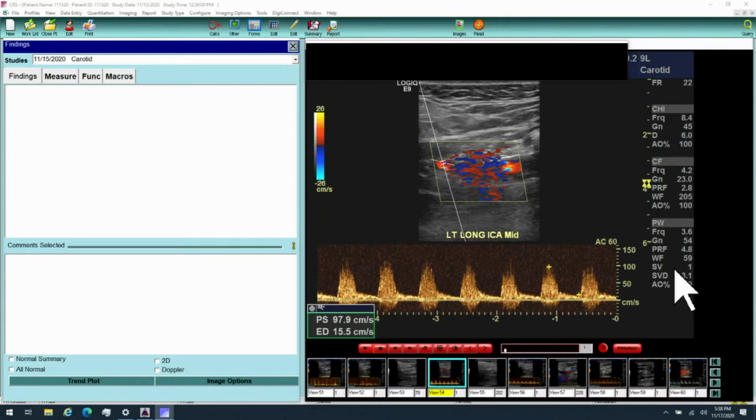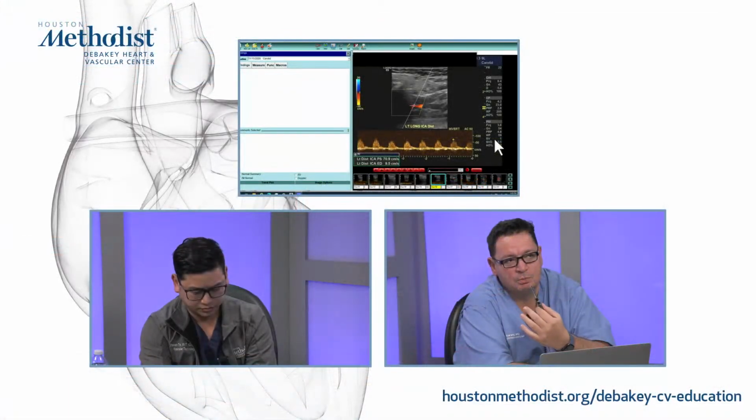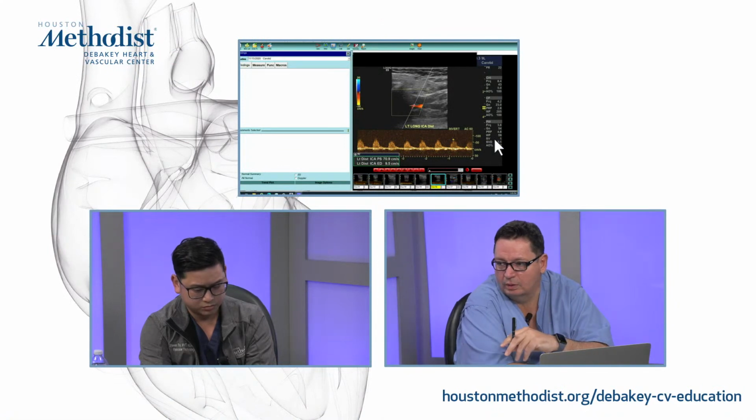The next waveform, I think it's the same. Can you show me the distal ICA? Sure. Same here, no branches, looks like a straight ICA vessel with a high resistance signal. One of the things I would ask is, is this ICA really open distally? With that high resistance signal, maybe an interpretation I would put is potential distal obstruction, maybe this is only feeding the eye, so maybe this ends up in the ophthalmic. The peak systole is quite high for a trickle of flow in an ICA, but this is definitely too high resistance to call it ICA.